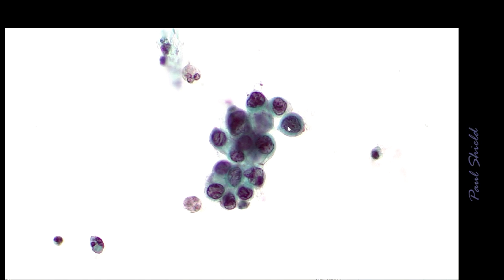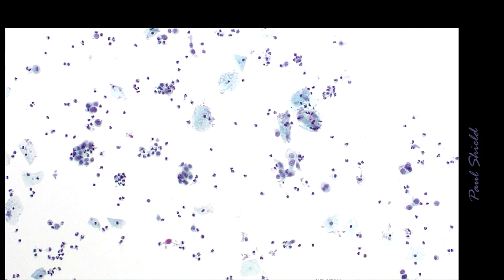See that one there still has really squamous cytoplasm. I can see the border of the cell quite well, and it's not columnar. It's a round cell with a nucleus centrally placed. But notice there's variation in nuclear size and shape, hyperchromasia, and quite high NC ratio. This case has quite a lot of them lying around. See, they're quite small. They're in little loose groups in this case.